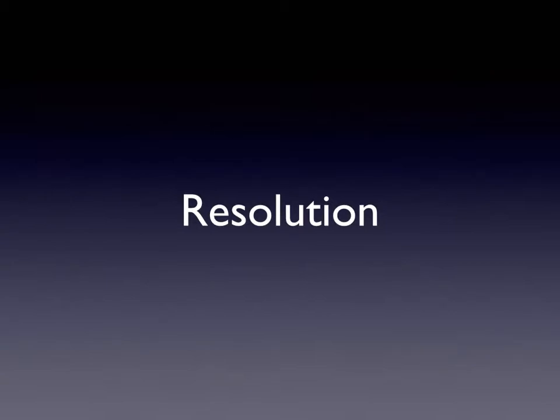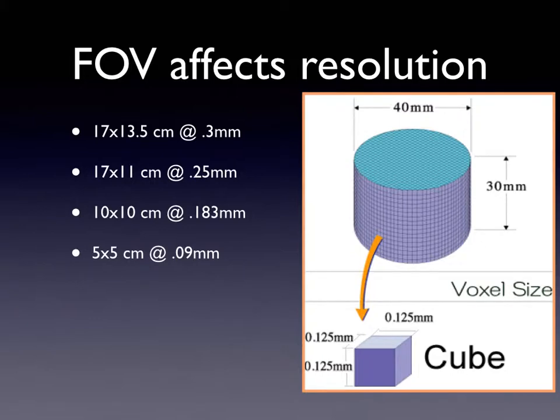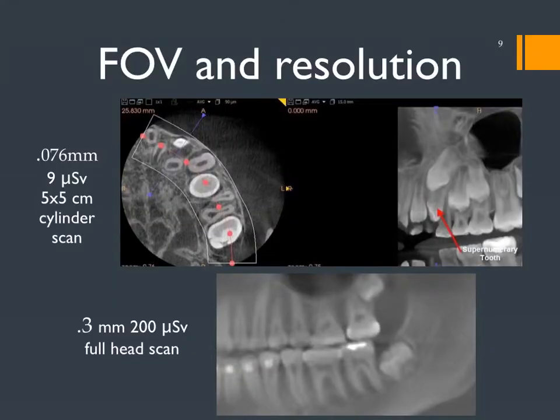So what resolution is useful for orthodontic diagnosis? Well, studies have shown that 0.3 or even 0.4 of a millimeter voxel size is really reliable for orthodontic diagnosis and treatment planning. But better than a 0.4 voxel size is, I think, very helpful. And for interdisciplinary treatment, it's actually quite important.